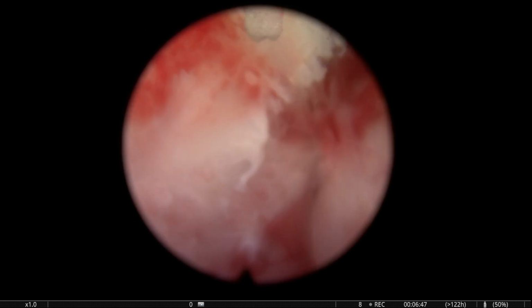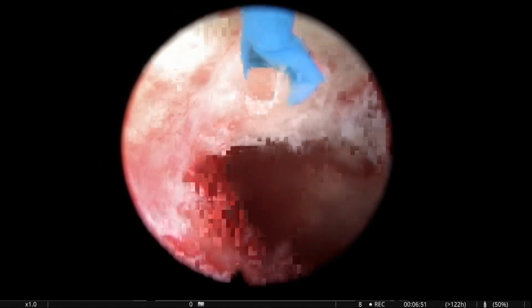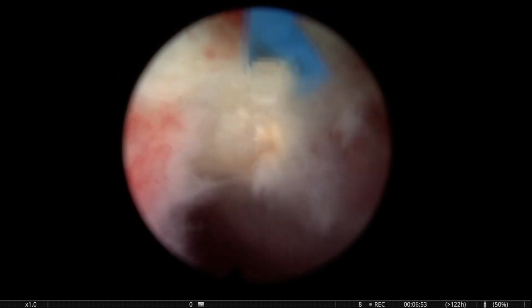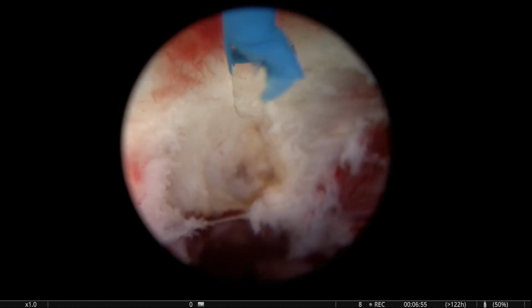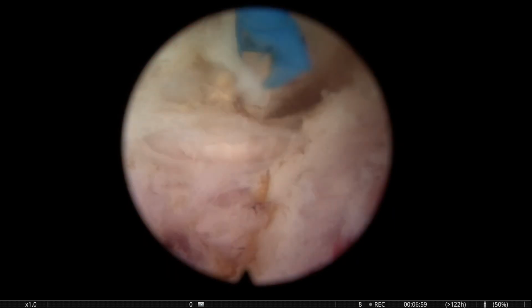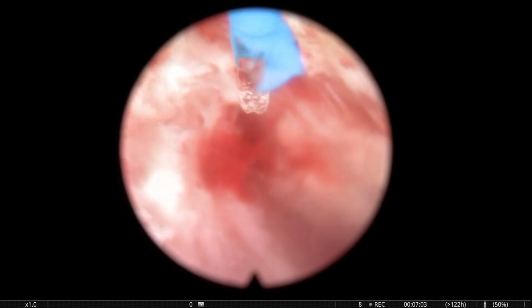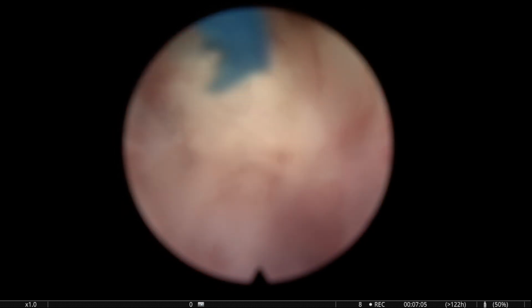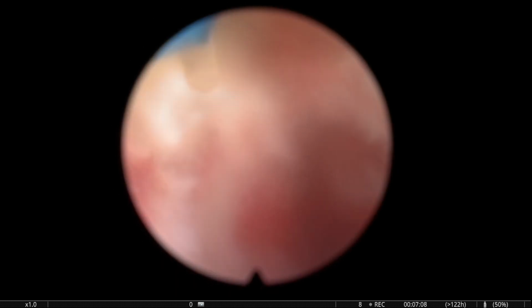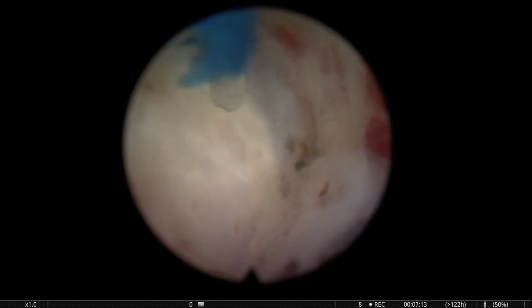So here now, this would be the start of the ascending dissection towards 12 o'clock. I always start by deepening the white line. Deepening the white line is going to open that tissue like a book, and typically the plane is going to be in the external page of that book, if I am making myself understood. But here you see, sometimes you doubt, is this a good plane or not?